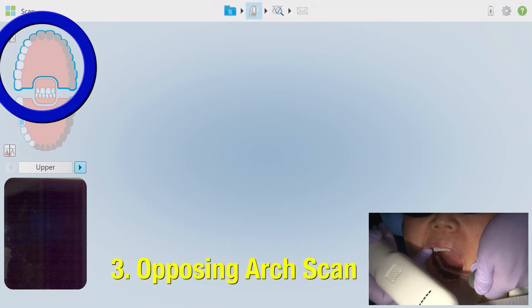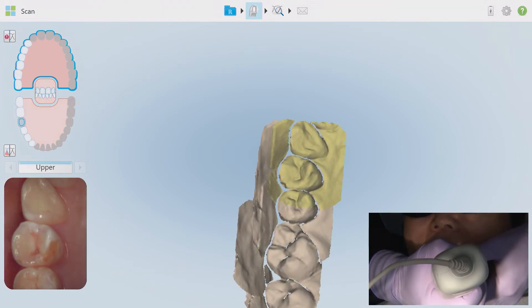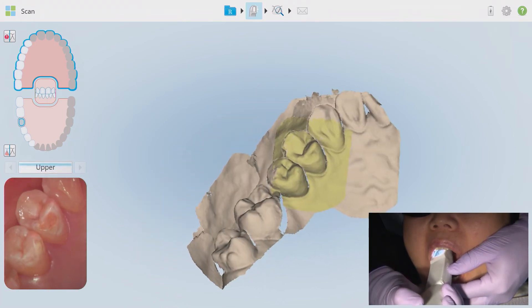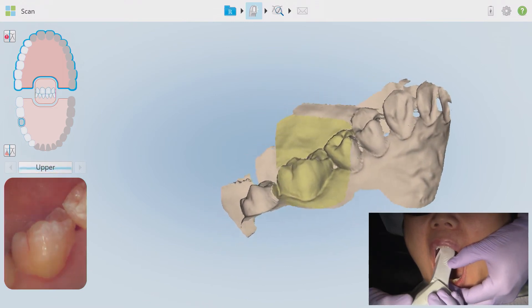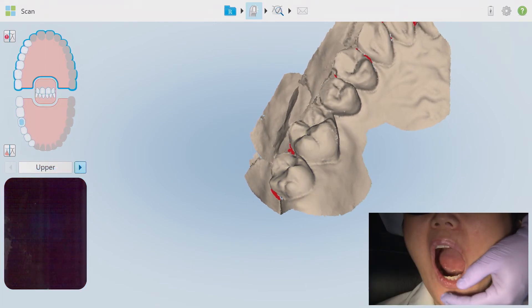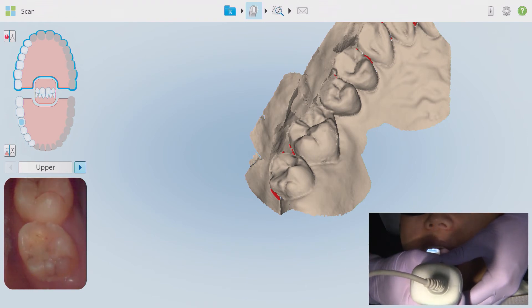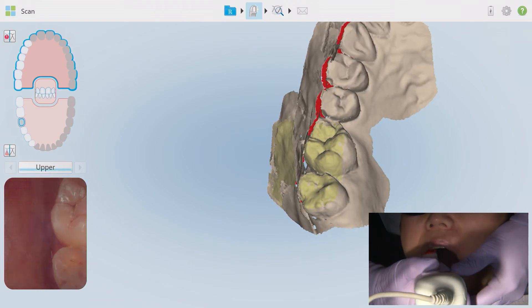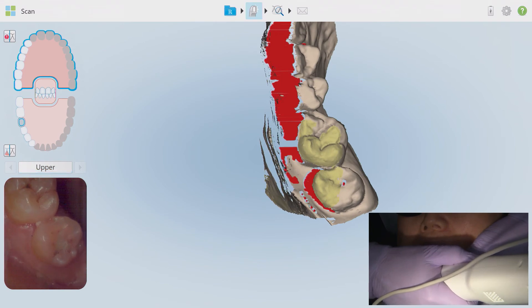Moving on to the opposing arch — in this case the maxillary quadrant — I've selected it on the visual chart. I'm not going to go into too much detail as it's the same principle as the working quadrant scan but without the tooth prep scan step. I'm starting distal occlusal of the most posterior tooth in the quadrant, scanning deliberately towards the cuspid area, wrapping around to the lingual and heading back towards the molars, twisting for embrasure areas, and then stopping the scan at the start point to reset for the buccal.